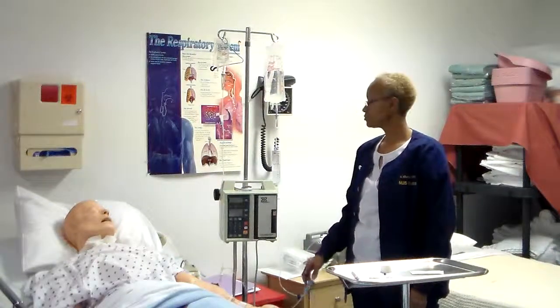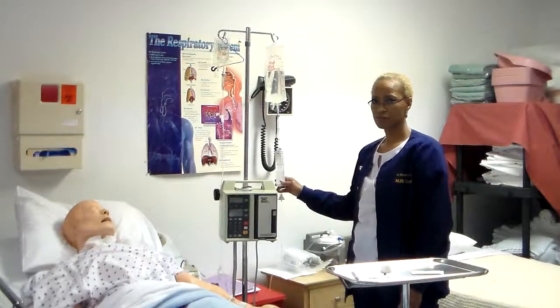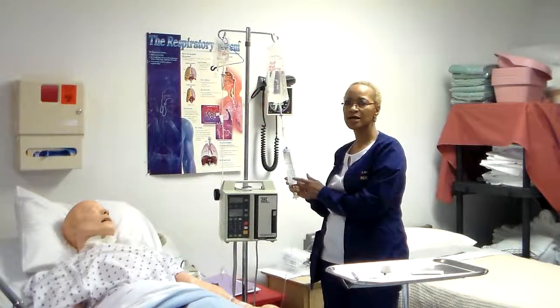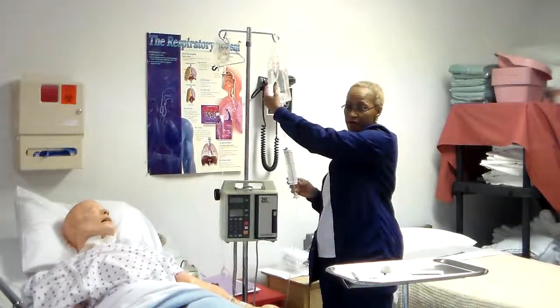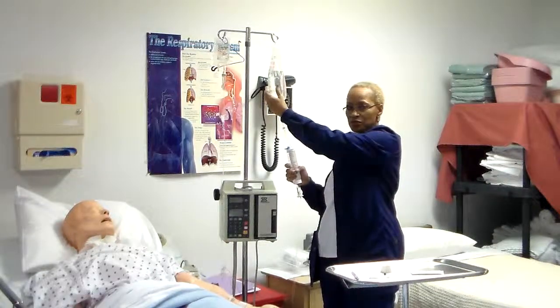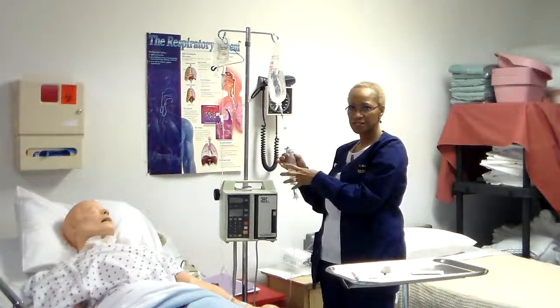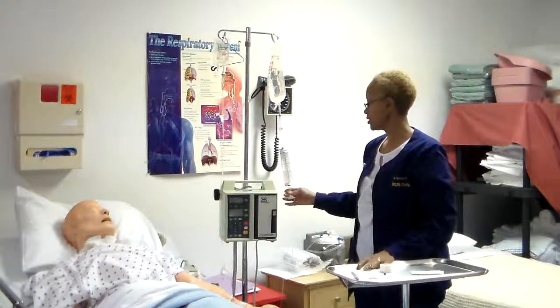Label Volutrol with name of medication, dosage, total time including diluent, and time of administration. Okay, so if you're not using a secondary bag, then you have to label this Volutrol so everybody knows there's medication in here. Because they're going to be expecting whatever you have in the bag to be here. But if you've added something to this, then you need to put a label here and make it nice and big so that they'll recognize that there's medication here, and I shouldn't add anything else to it until all this fluid is gone, because that's where the medication is.